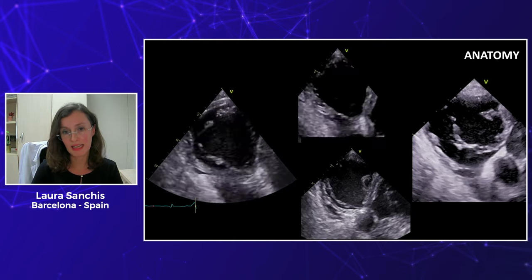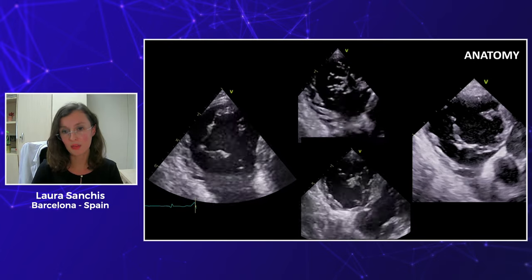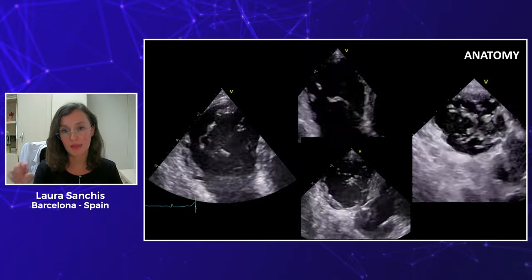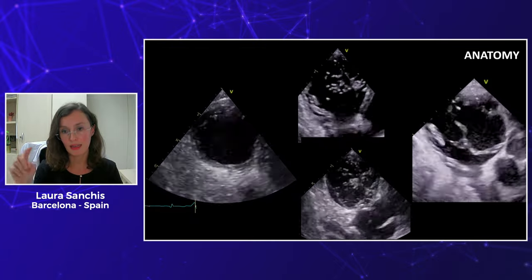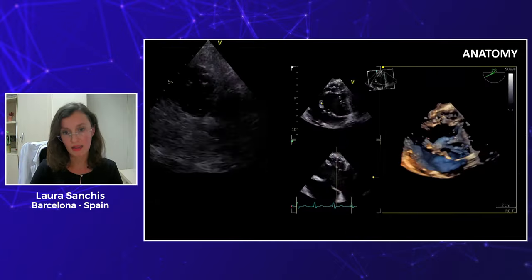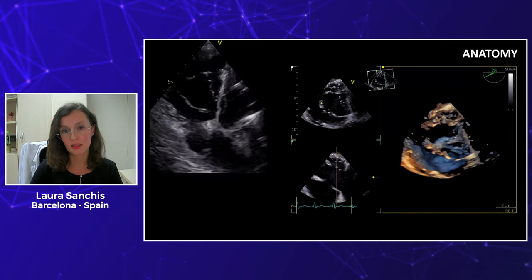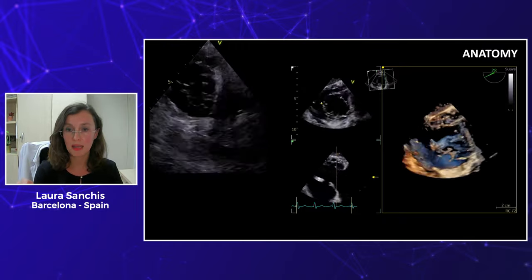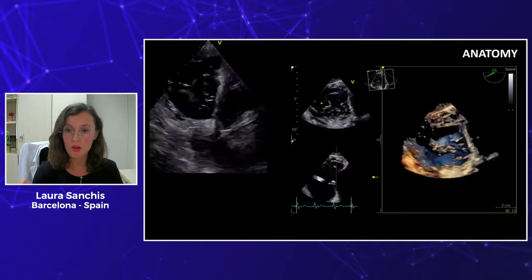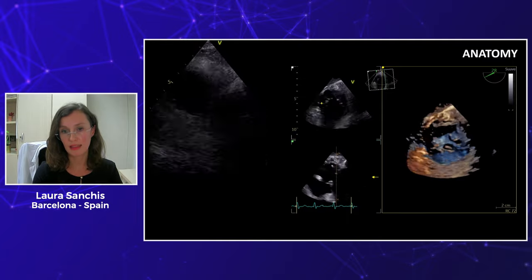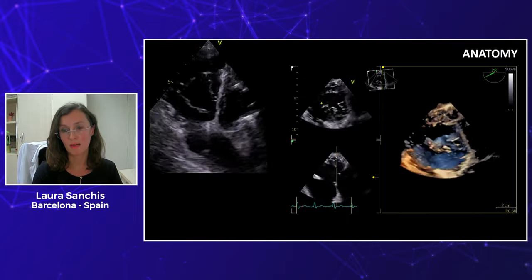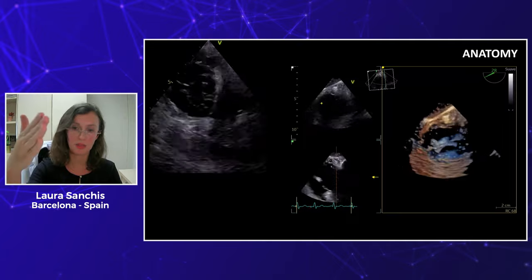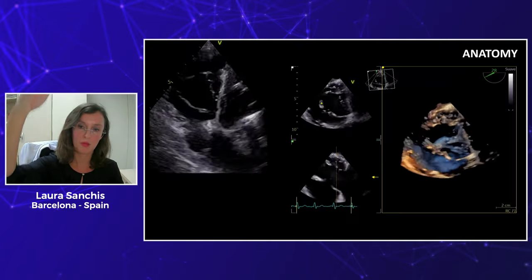To evaluate anatomy, use a nice short axis view in the transgastric view — this is where you can identify the number of leaflets and where the commissures are. If you do a 3D directly from this view and reduce the gain, you can identify the papillary muscle. Everything anterior to the papillary muscle will be anterior, and everything in the posterior part on the free wall will be posterior.